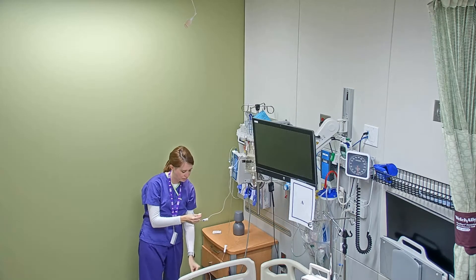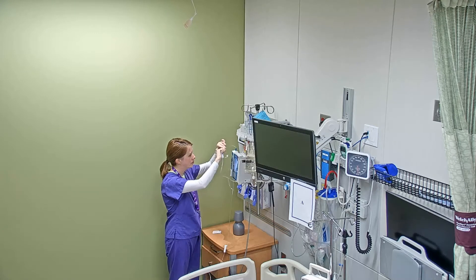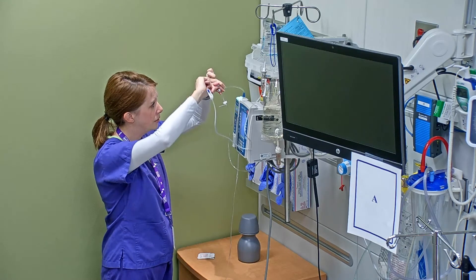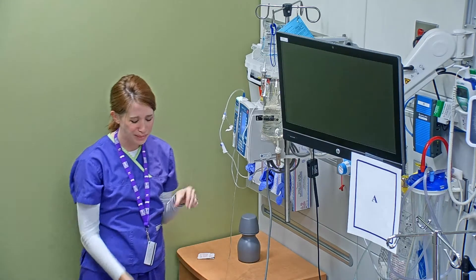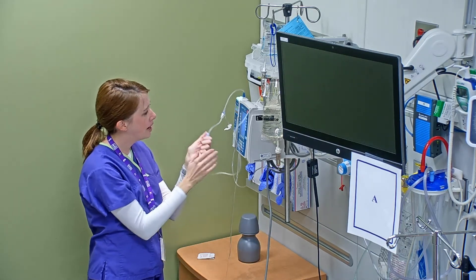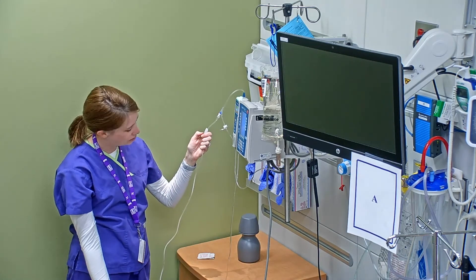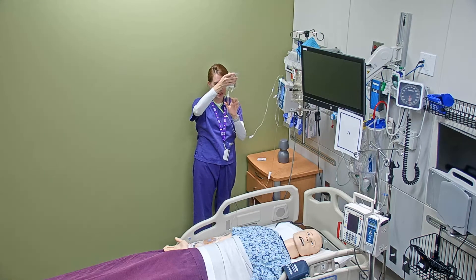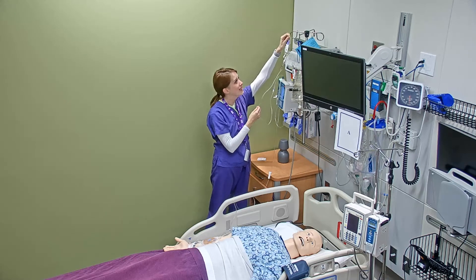Now I'm going to take an alcohol swab and clean off my port. Then I unscrew the cap and connect it. You'll notice that my pump is still running at the normal rate. Now that my port is connected, I'm going to roller clamp open this line and drop it down. Basically my primary bag is filling my secondary tubing. I'm watching the drip chamber — I want it to be about a third to a half full. Once it gets there, I just need to raise this up higher than my primary bag.